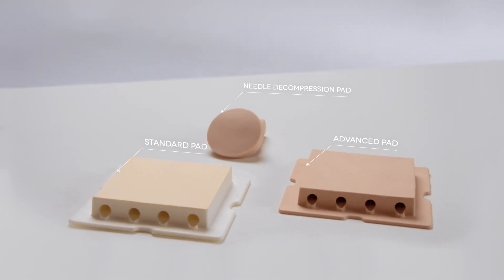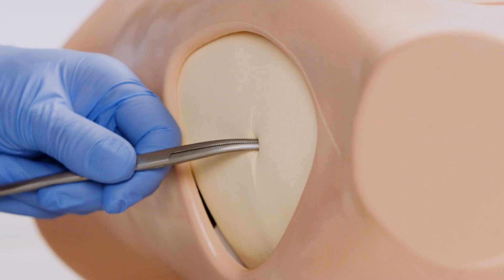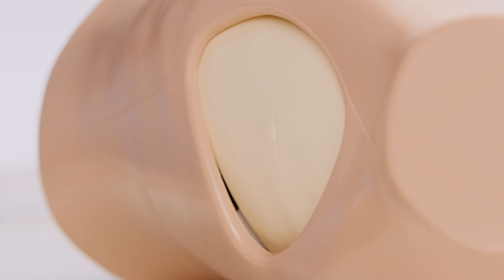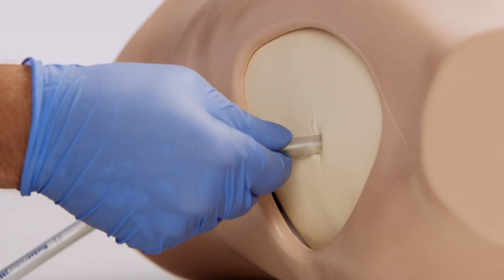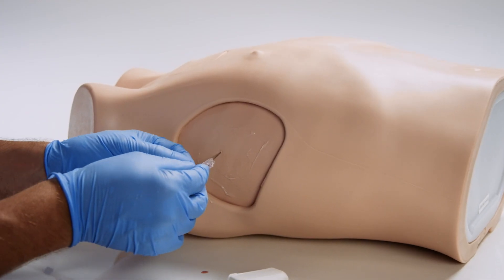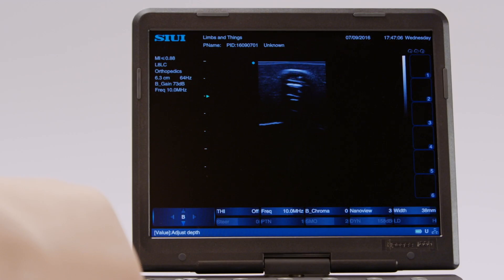The standard pad is ideal for practicing blunt dissection chest tube insertion and suture of the tube to the chest wall. The advanced pad is designed for ultrasound-guided procedures, specifically the Seldinger technique and for hemothorax simulation.